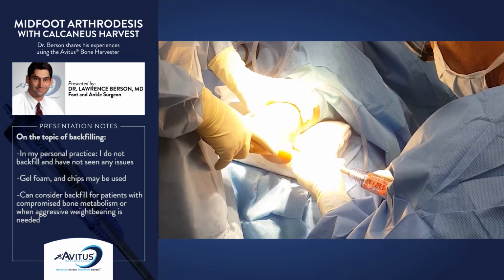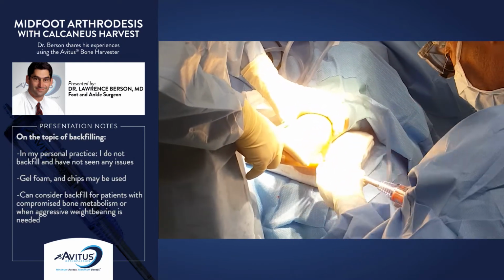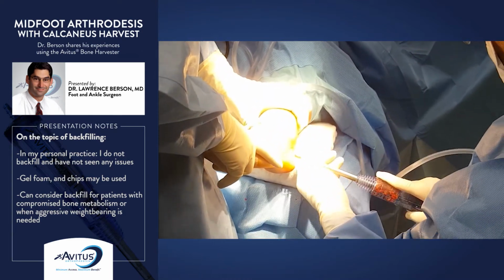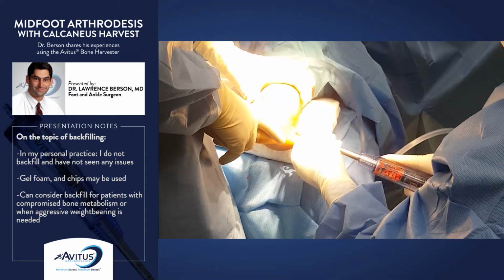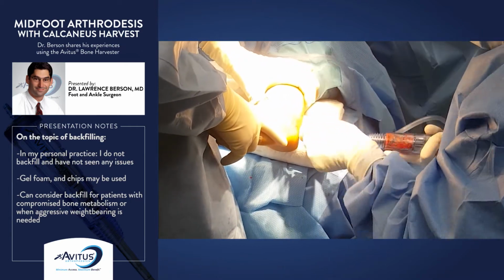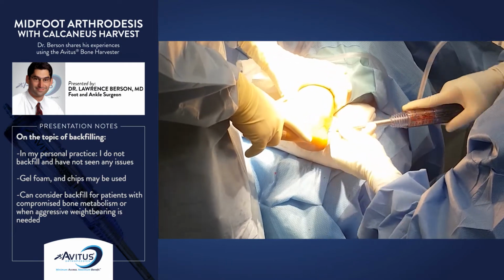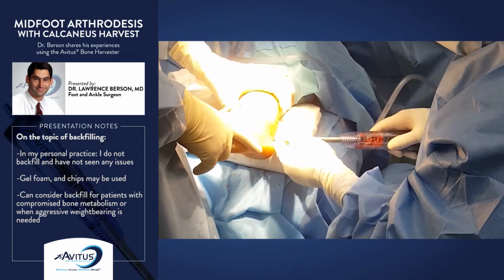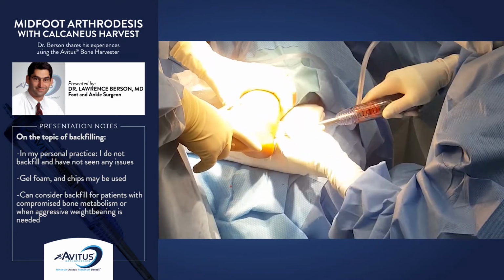On the topic of backfilling, I haven't seen it necessary to backfill. I have not seen stress fractures or any significant reasons to backfill. If you, for some reason, were very concerned about a stress fracture afterwards, there's no reason you can't backfill, but I have not found it necessary in my practice.